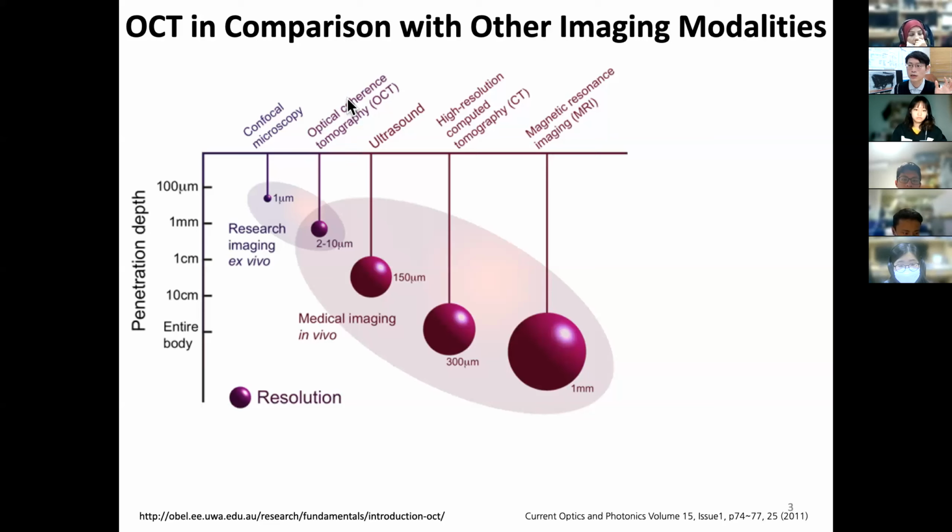but there are other techniques, just using a high numerical aperture objective. You can make optical coherence microscopy, which can target less than 10 microns so that you can see cellular resolution. But what's very interesting here is OCT has a penetration depth on the order of 1 millimeter, which is 1 transport mean free path. So this is great in terms of optical imaging.